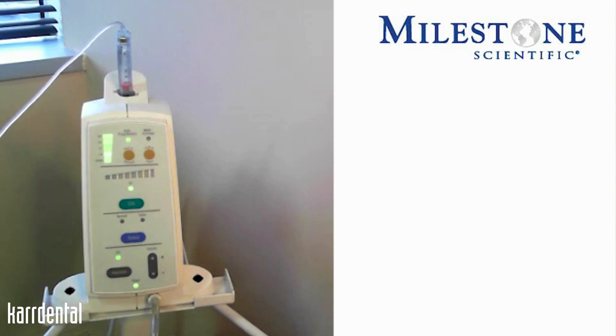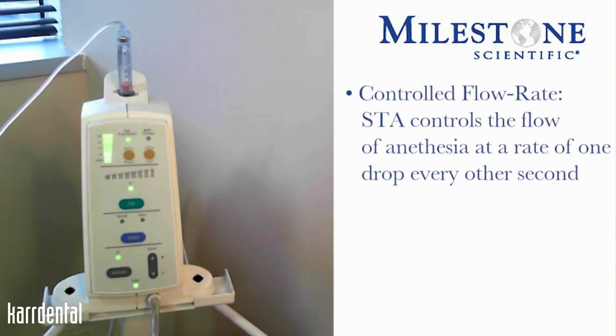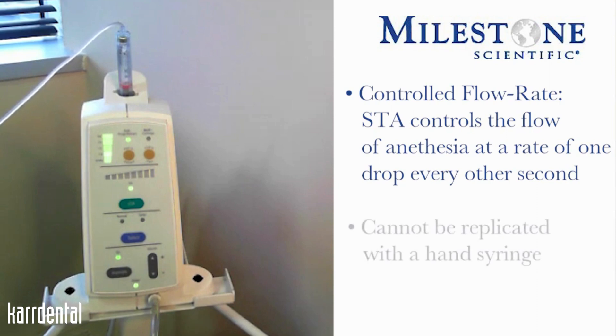In these two sections here, we have our different flow rates of anesthesia depending upon the injection technique we're doing. The STA is also referred to as the controlled flow rate, meaning that the instrument controls that flow of anesthesia at a rate of one drop every other second — a flow rate that cannot be replicated with the traditional hand syringe.